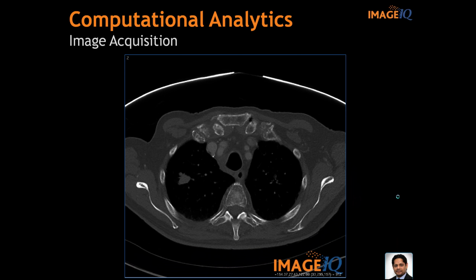But this is just the general way that you present this in clinical practice. I don't know if Andrew, you agree, this is what you would generally do. This is a pretty typical prose type report. Some of us are trying to move more towards a standardized format and make it easier on the eyes, where target lesion measures this, previously that.